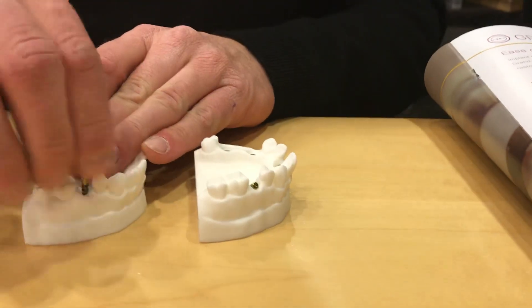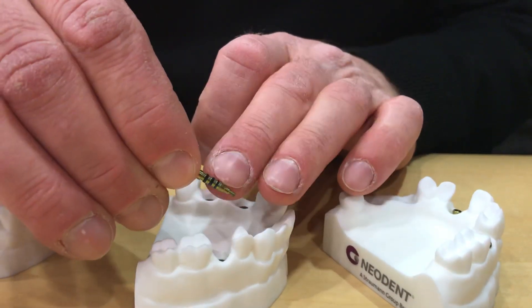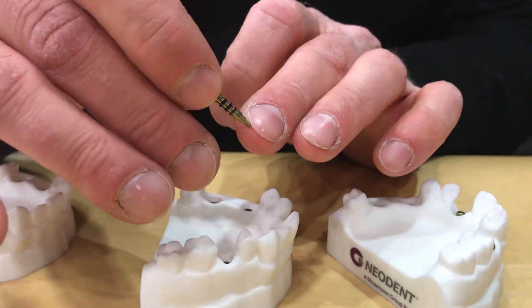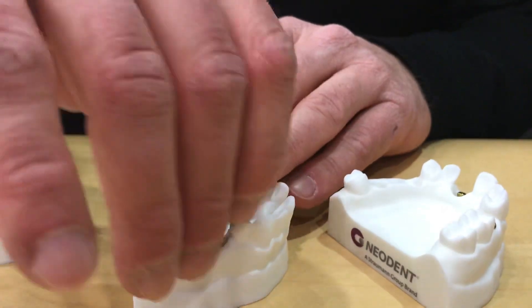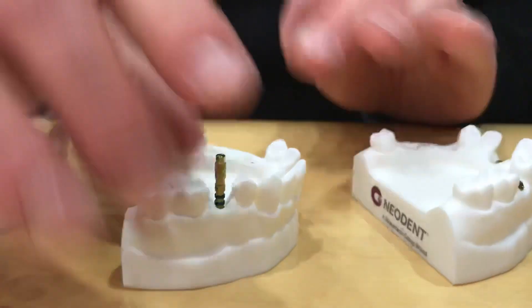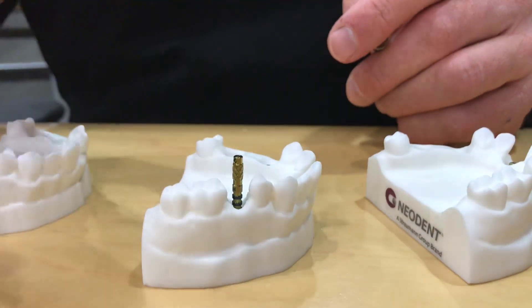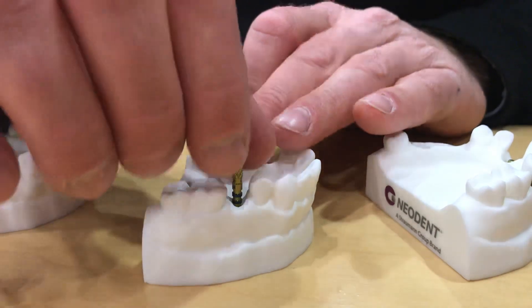We remove our healing abutment and slide over to our next model, which has our tissue measurement gauge with a bunch of lines on the side. It's also threaded on the apical portion to place down into the implant. We turn until it's tight — we know it's fully engaged in our implant — and then we read those lines to see where the top of our gingiva is. This is huge for aesthetics.